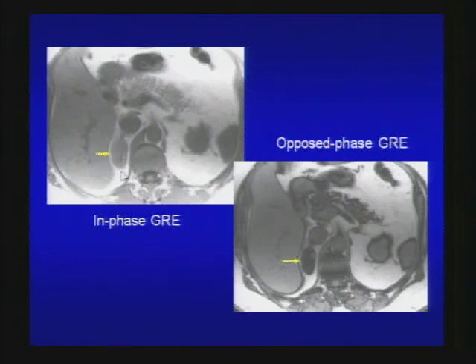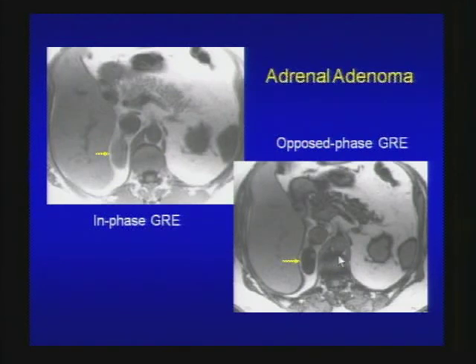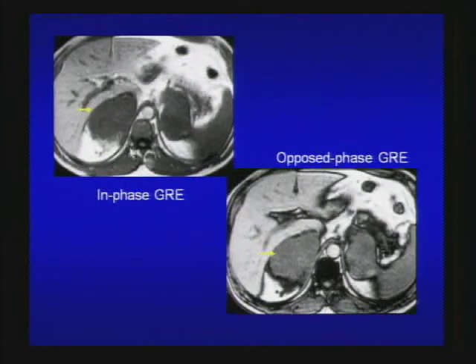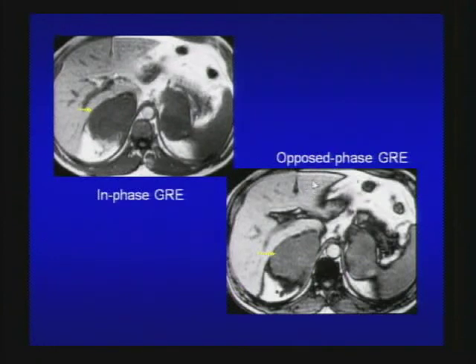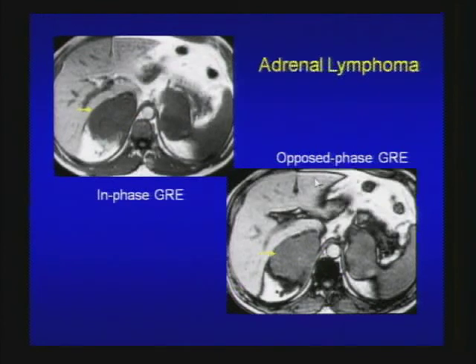An incidental right adrenal mass demonstrates significant signal dropout on the opposed-phase image — characteristic for benign adrenal adenoma. Another case: large bilateral adrenal masses, non-specific, does not demonstrate signal dropout on opposed-phase. Differential would include adrenal lymphoma, metastasis, or possibly pheochromocytoma. This turns out to be a case of adrenal lymphoma. On oral boards, look at the images and give a differential — you may get additional history which directs you to the correct answer. If you give a reasonable differential, that's enough.